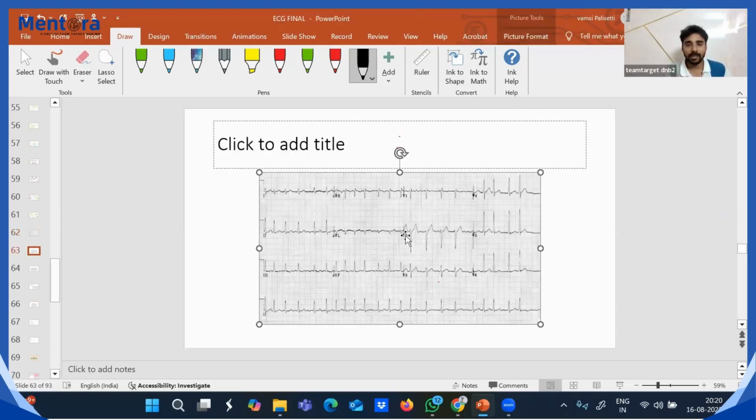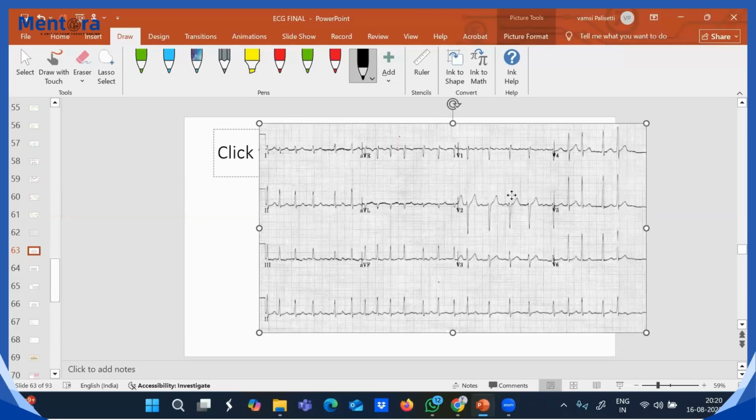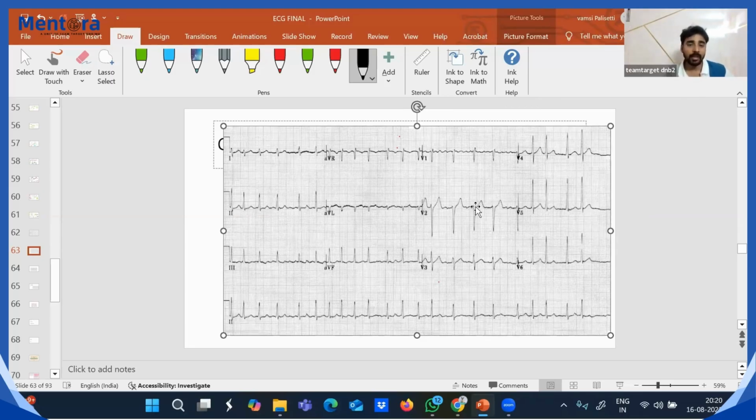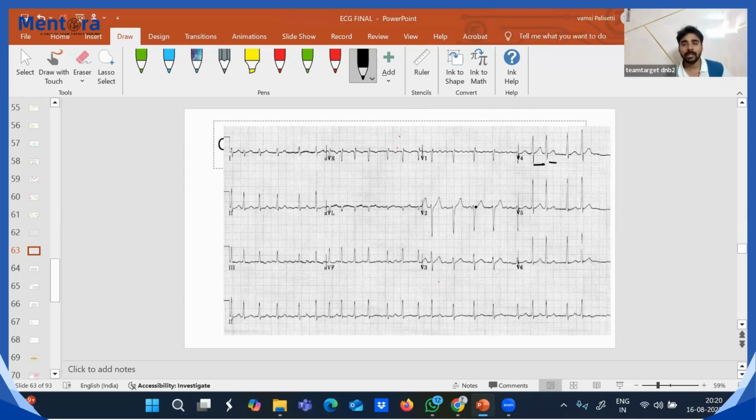Identify this ECG fast. We can go. For narrow complex tachycardia, it is irregular, irregularly irregular. So mostly AF. Sometimes you may see P waves. Everywhere here is only 1 or 2 boxes, here some 3 boxes, irregular. Irregular narrow complex, AF only. No need to think much.